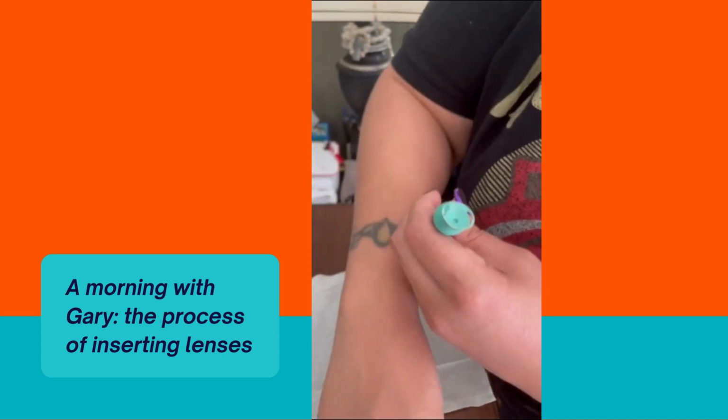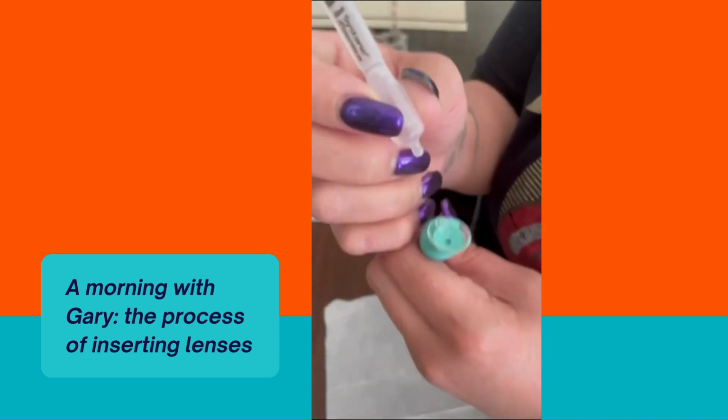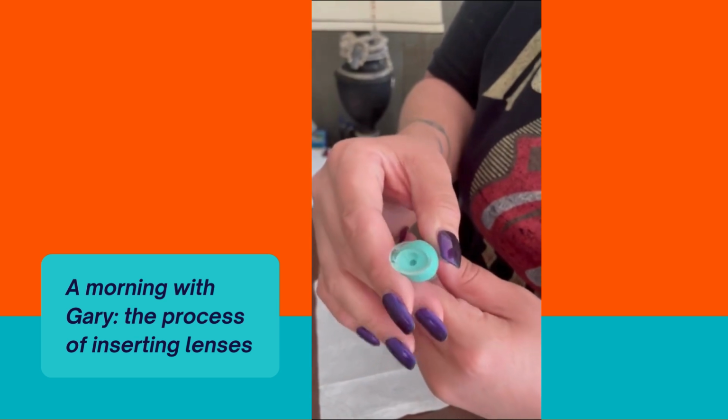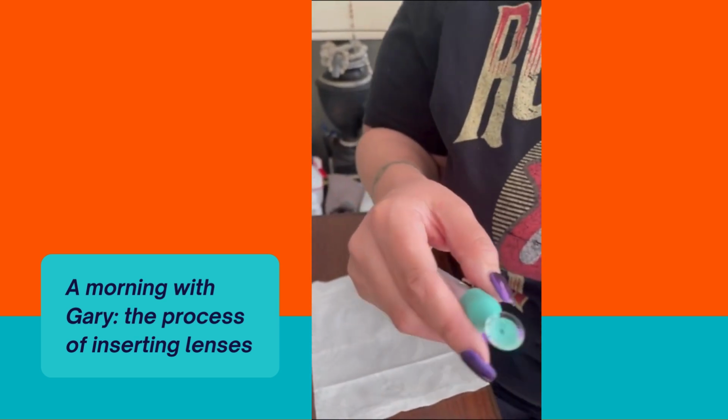Top for where you're going to flop. And also, once again, I'm right-handed, so they both go this way because I'm right-handed. If you're left-handed, it'll definitely be swapped the other way.